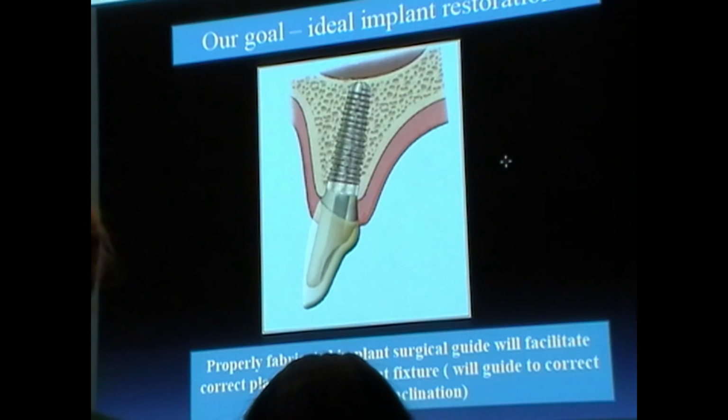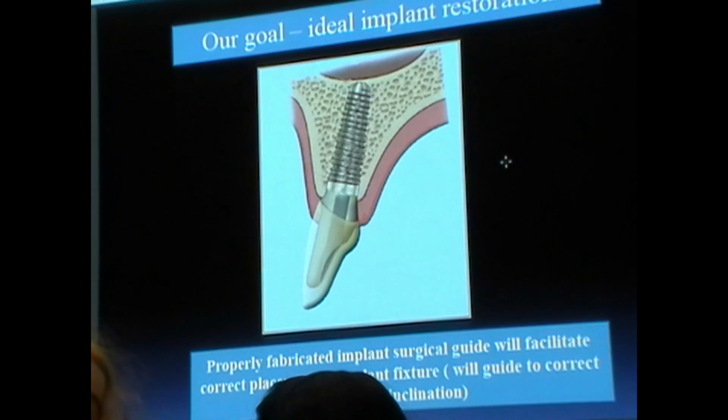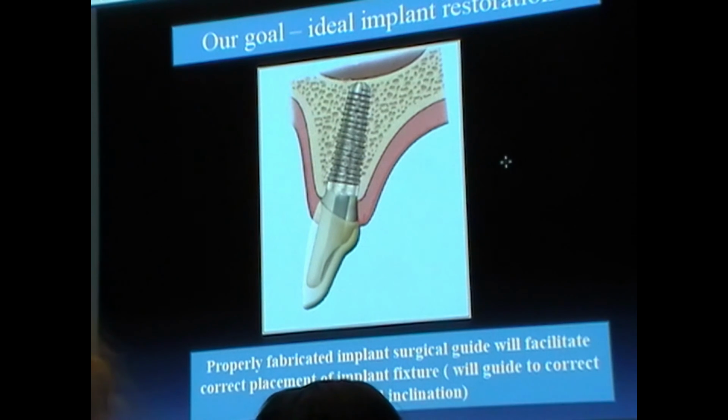Yes? Do you write numbers on these components? No. All of the components come packaged in something. What I would suggest you do is hold on to it and, if you have a Ziploc bag, put it all in the same place. Okay, for now.